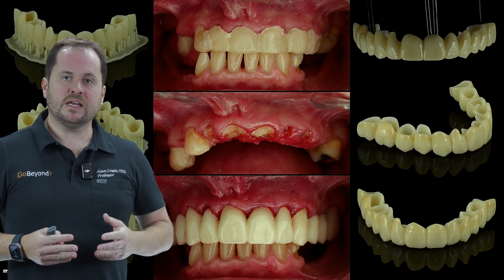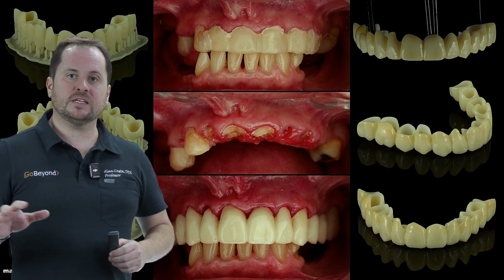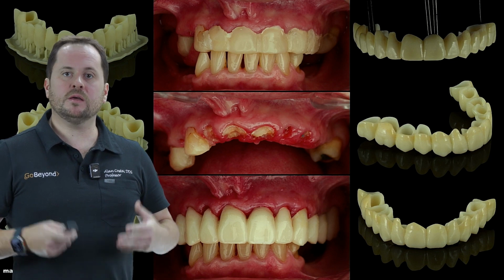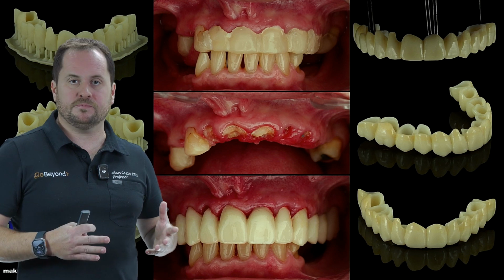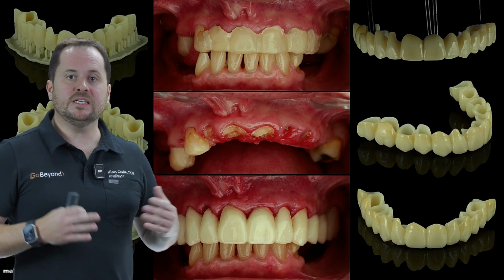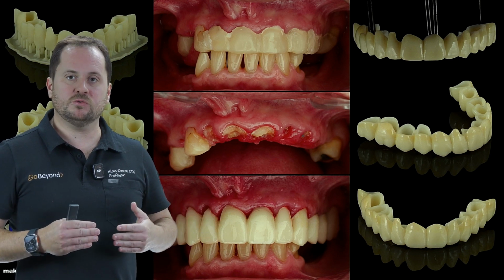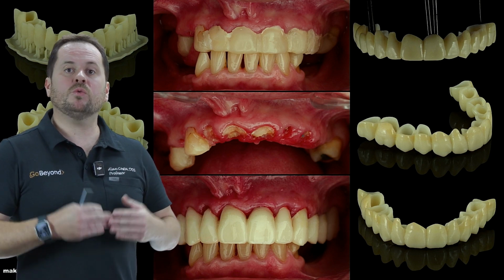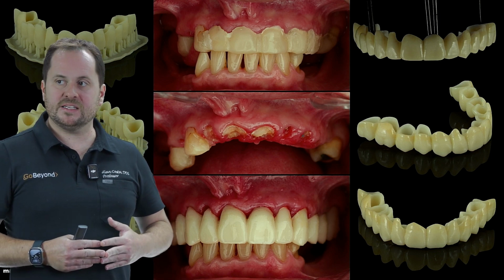This adjustment we made, we specifically requested the prosthetics laboratory to make this set of temporary prostheses for us, which would be a fixed denture. We were going to make a very supportive denture. In this image you are seeing here, no type of implant has been done yet. A provisionalization was made for this patient based on the root situation and the remaining teeth that the patient still had.